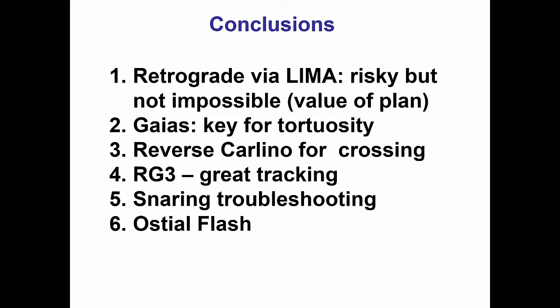This case also shows the advantages of the composite core Gaia guidewires. This may not be seen in more simple cases, but in this case where we had to navigate through the tortuosity of the LIMA, literally the only wire that made it to the tip of the Corsair catheter was the Gaia wire. Third, when we have an essentially impenetrable lesion or are stuck and cannot advance anymore, using the Carlino technique — in this particular case the reverse Carlino, done in the retrograde direction — can help us modify the plaque and cross through the occlusion.